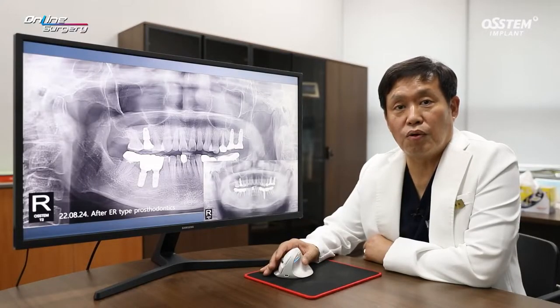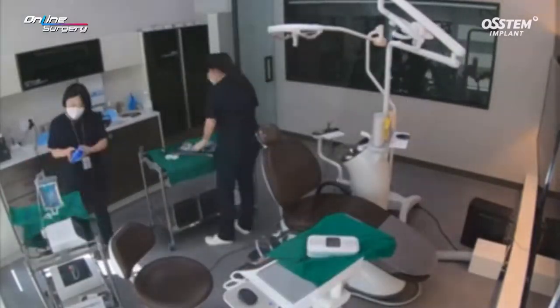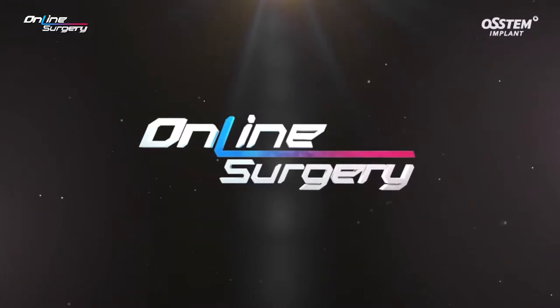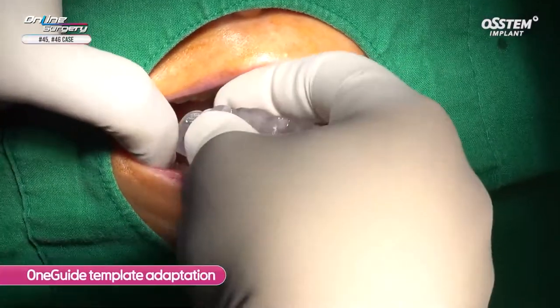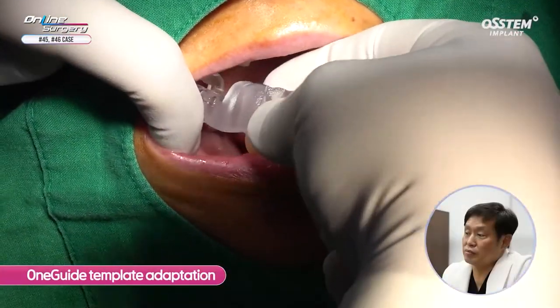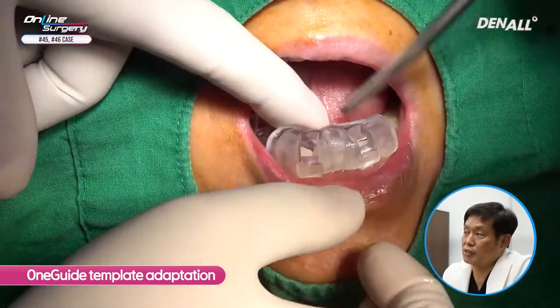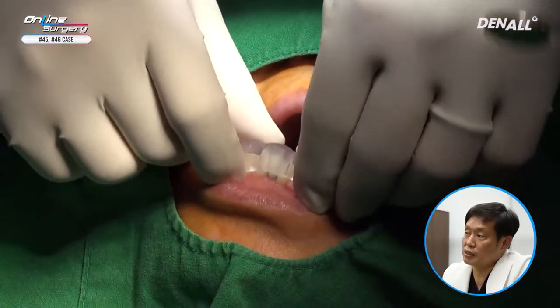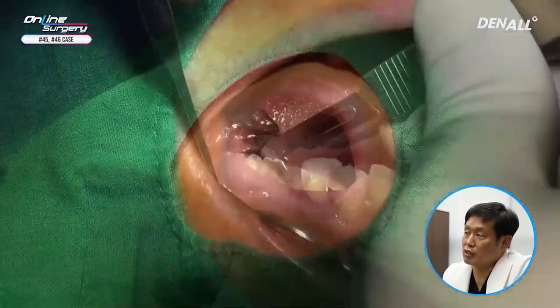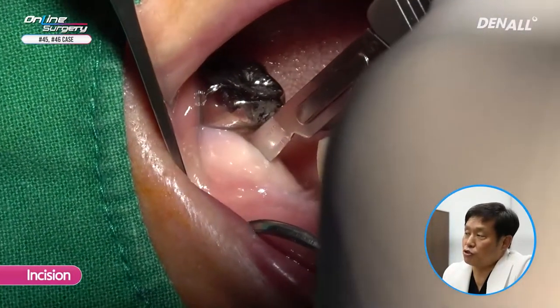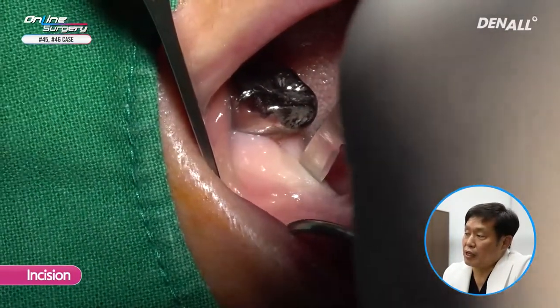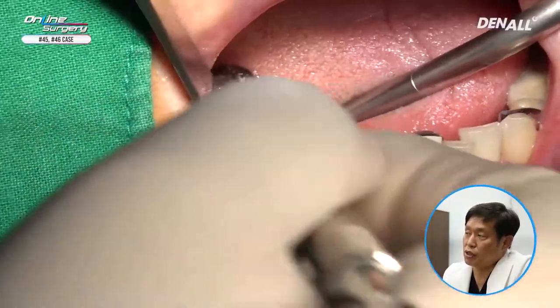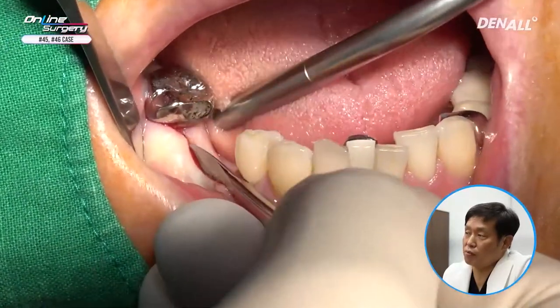Let's look at the surgical clip. You can see that within the patient's mouth, the OneGuide template is being adapted. The OneGuide fits quite nicely — I confirmed it. Because I was planning for GBR, incision was made. On the buccal side, minor periosteal elevation was done to reflect the flap slightly.